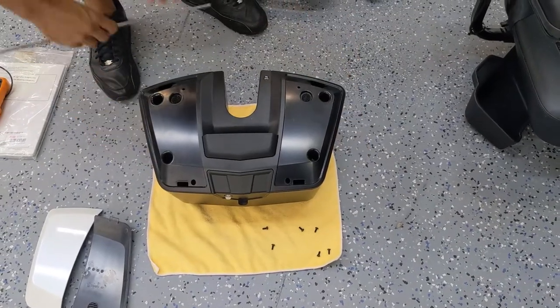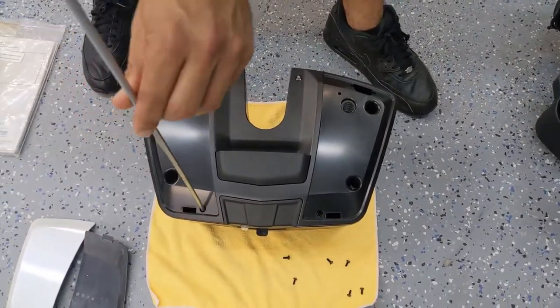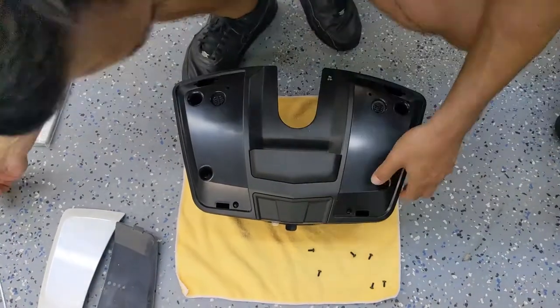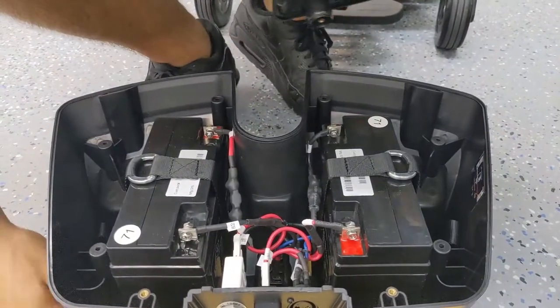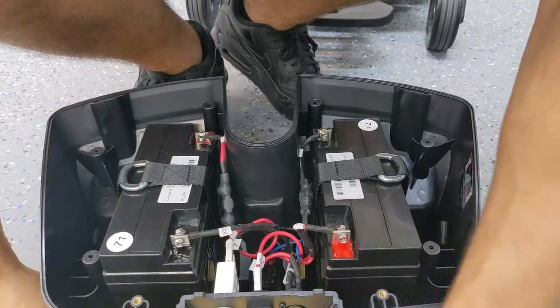Now at the top, we need to remove two more screws. At this point, you can lift the flap that shows the charging port, the fuse, and the breaker switch.